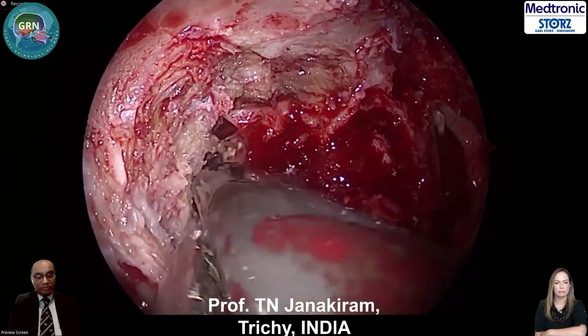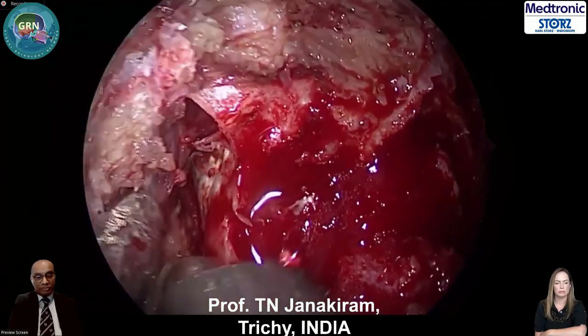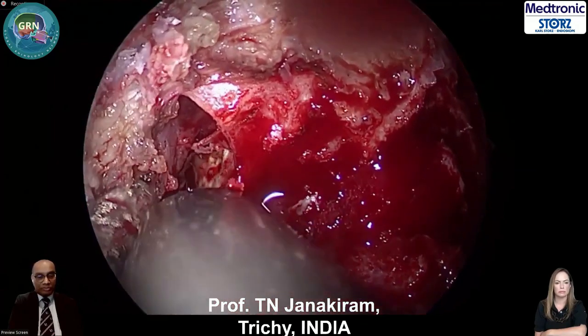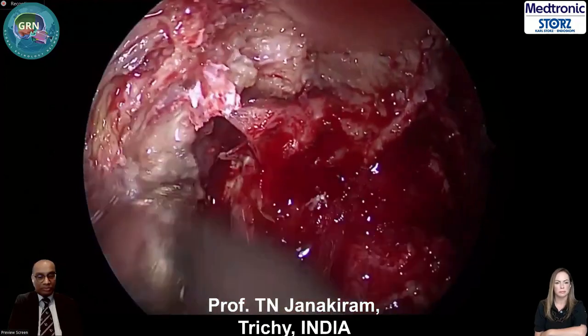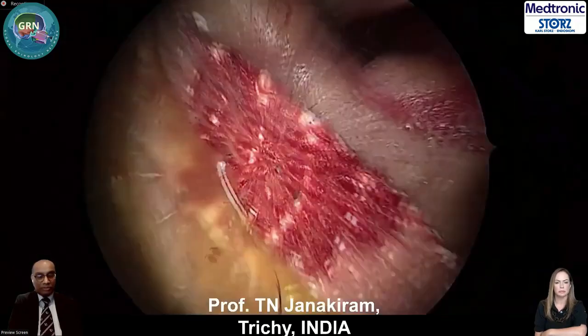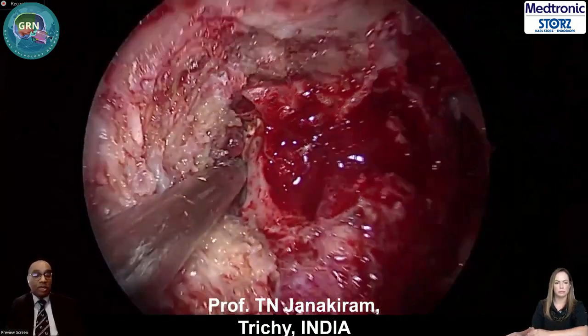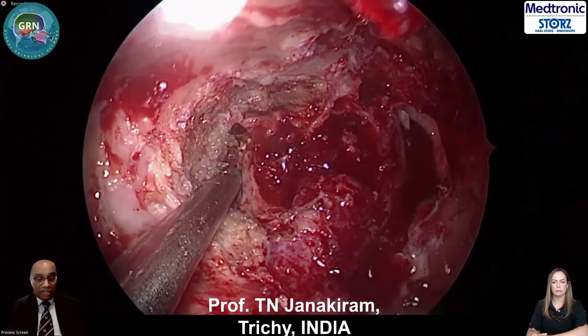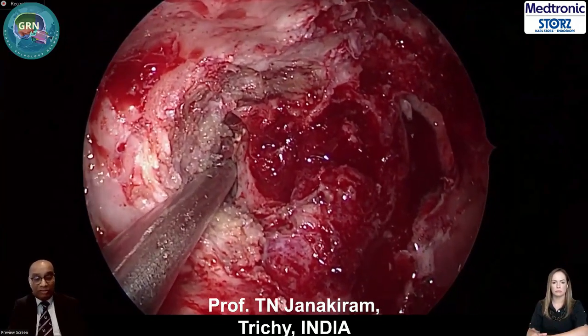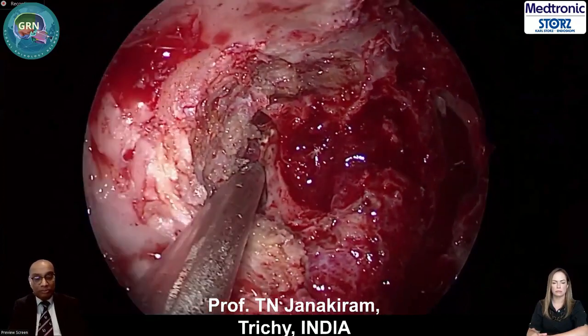I just finished off. So this tumor practically has got no arterial supply now. Only the venous supply is there from the pterygoid venous plexus. So all the tumor coblation was enough to secure it. That was not the main IMAX, it was just the feeder vessels. Give me the drill.